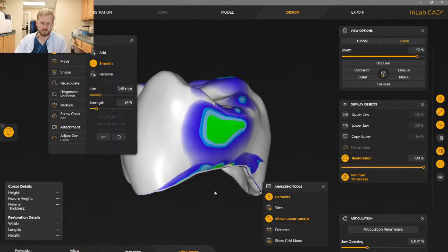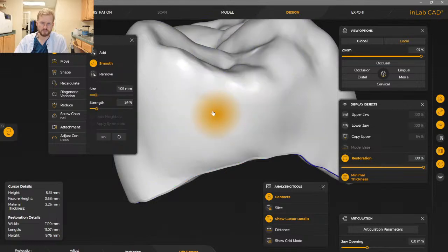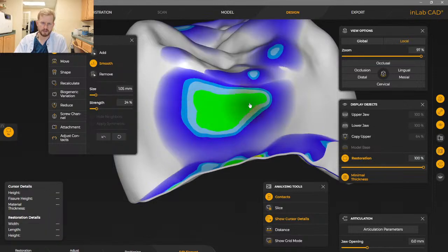Yellow is too much green for me. Okay with the big, wide, double turquoise spot. I'm not okay with a massive green area because that's going to make it miserable, if not impossible, for us to see. So we will smooth that out some.